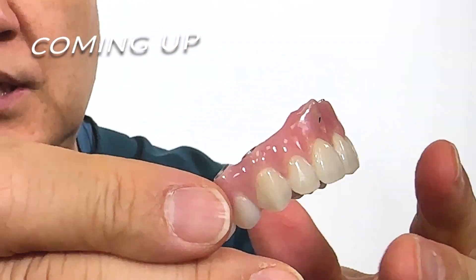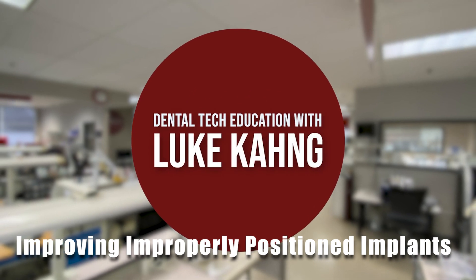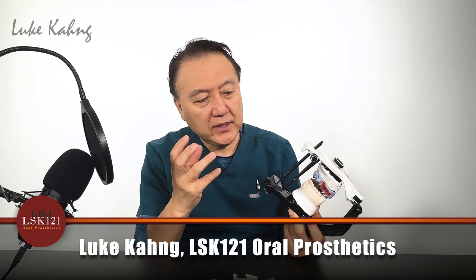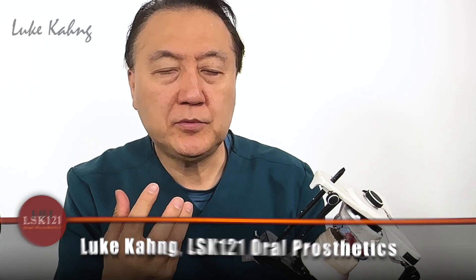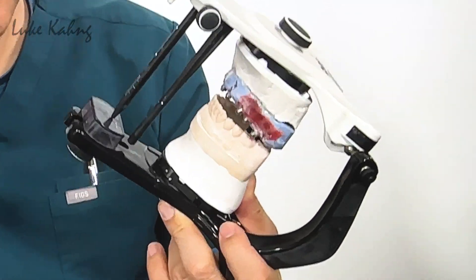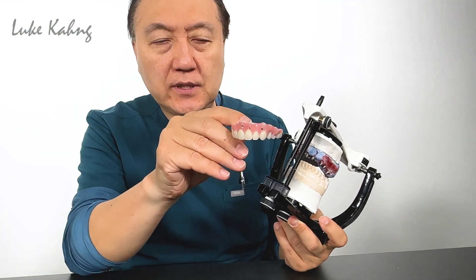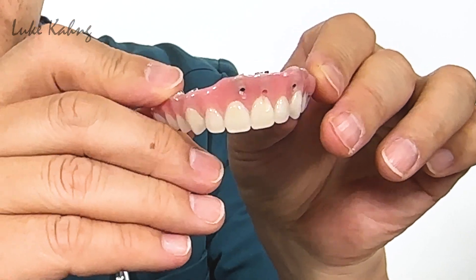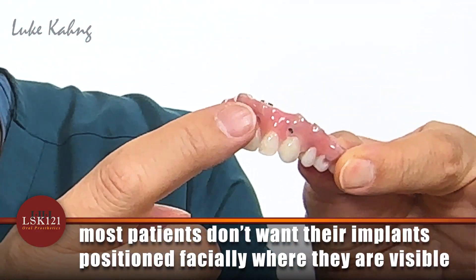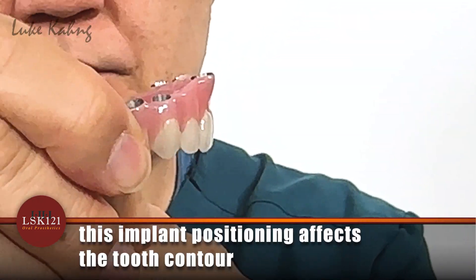There are so many things we can do here with these implant cases. So many implants were placed with the patient's mouth and some of the implants were not properly placed. As a result, we just increase the facial implant sticking out facially. Probably 95% of patients don't want to see their implants here, and the vertical contour will be different.